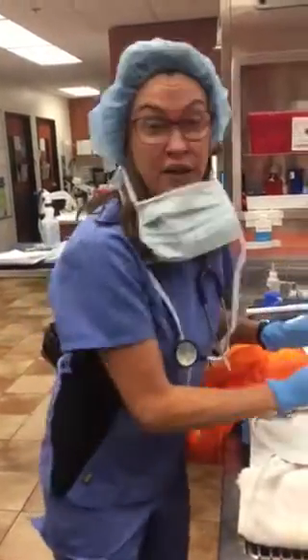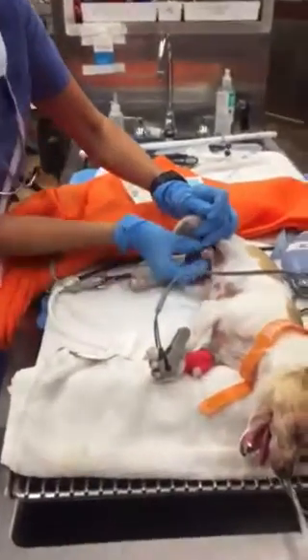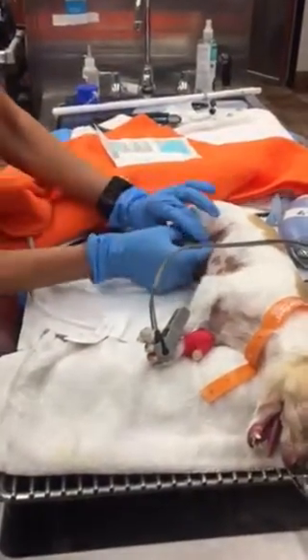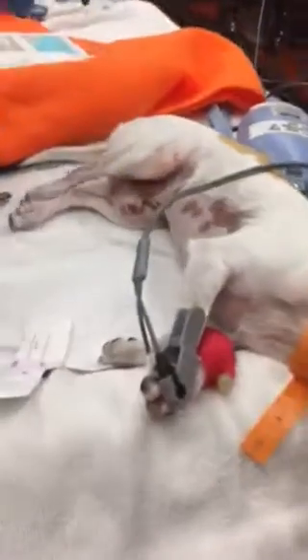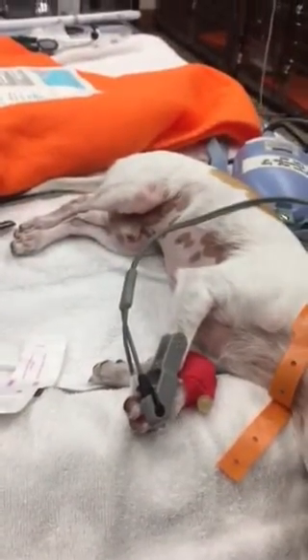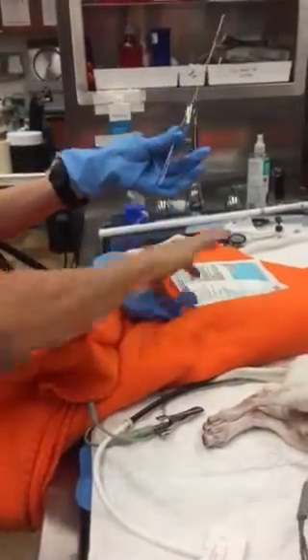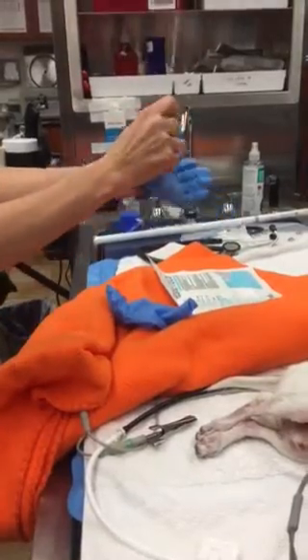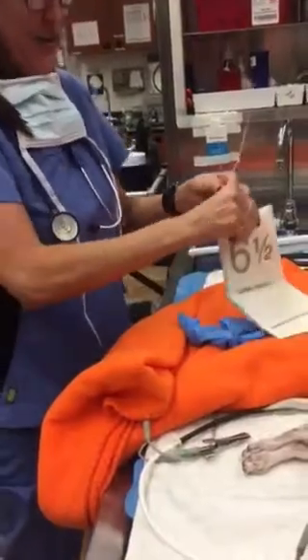Urinary catheterization on this dog. What I'm going to do is prepare the area and pull the prepuce out. Everything prepared is with these gloves, and this is going to stay sterile. After the area is all prepared and I have everything in place, I am going to change the gloves. I need someone to open my gloves. Okay, so I have sterile gloves — thank you.